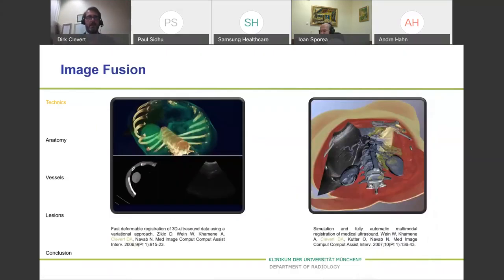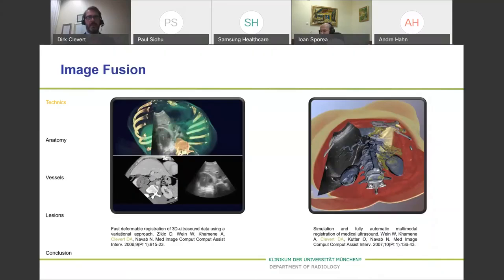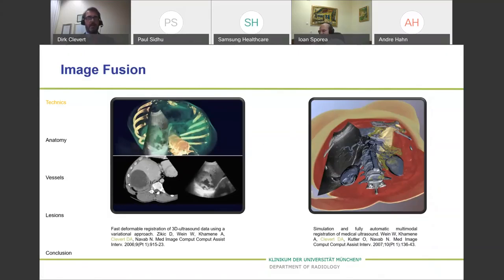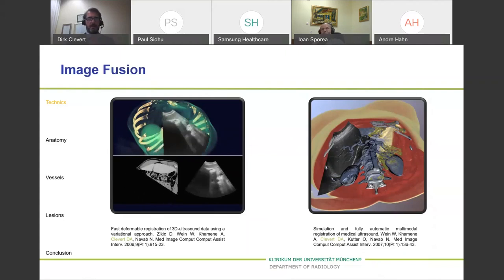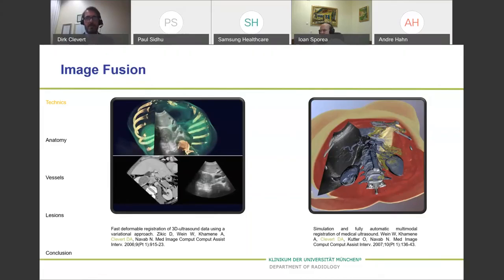We did our first scientific research regarding fusion in the year 2005, which was published in 2006. At that time, nearly 15 years ago, the calibration of the system took us 3 hours. This was only for scientific research, not for diagnostics. Nowadays, you can do this with higher quality in less than 1 minute. So it is a really big improvement in comparison to the past.